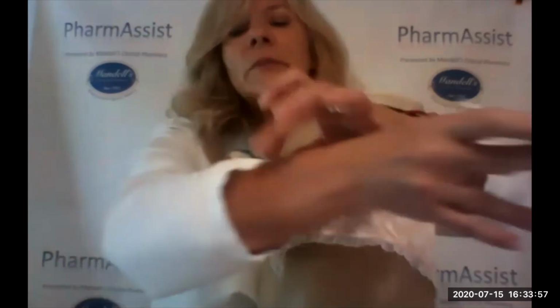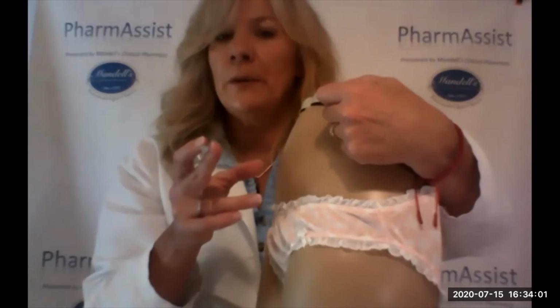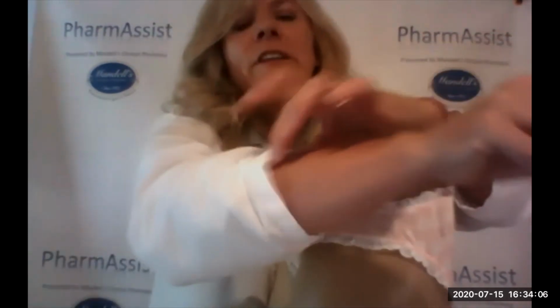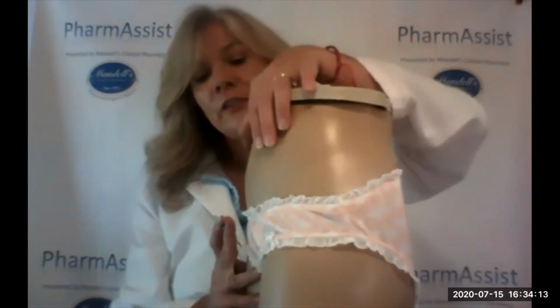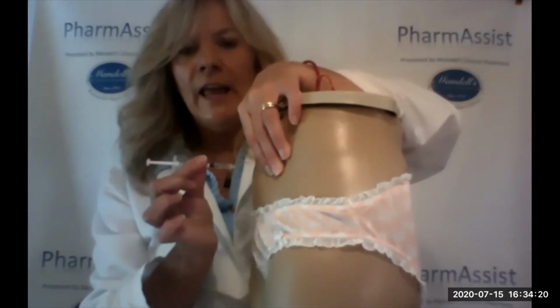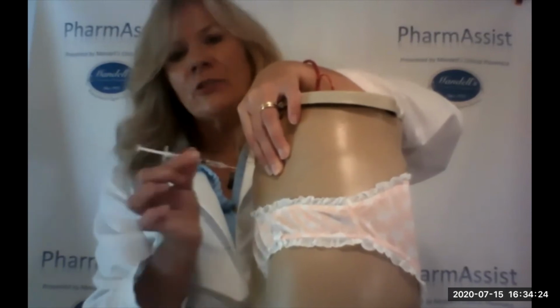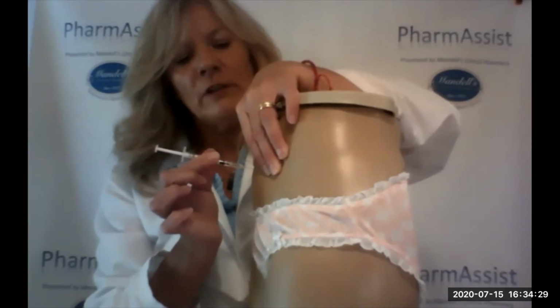But the key is sometimes if I see somebody that might have multiple bruises, I might have them show me the technique of their pinching, just to make sure that they're not pinching too tight. So it's really just lifting the fatty tissue up off of the muscle, a nice, gentle lift. I like to think of it as a lift versus a pinch. So we're going to give a little lift to that fatty tissue. We're going to angle the needle straight in, and we do not need to jab, okay? No reason to traumatize the skin that way. Just place it gently to the skin, give a little pinch.